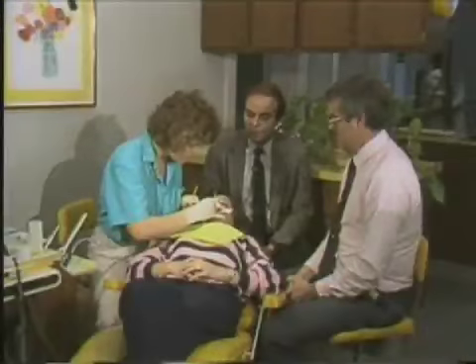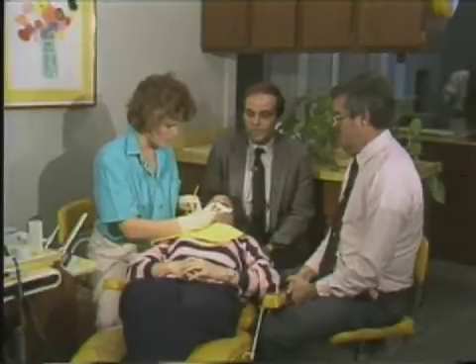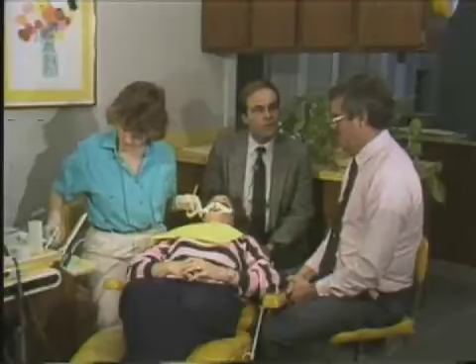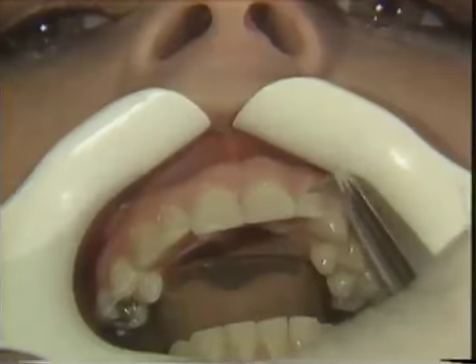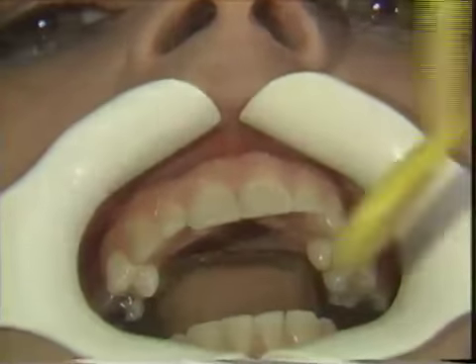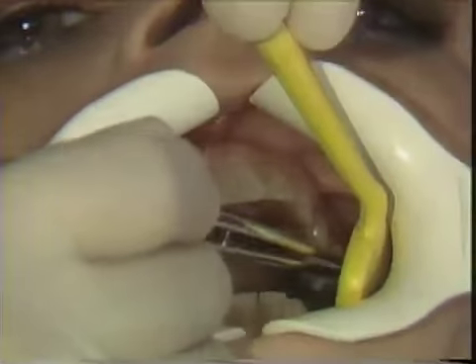The etch should be applied in a dabbing motion, never rubbed or swiped onto the enamel, because once the acid touches the enamel, you've exposed the enamel tags, and these are very delicate and can be knocked off. It's dabbed onto each tooth and allowed to remain on permanent teeth for 60 seconds. For deciduous teeth, it would be 120 seconds.